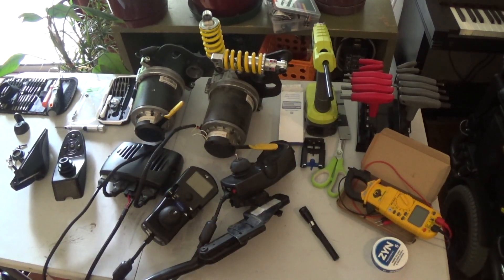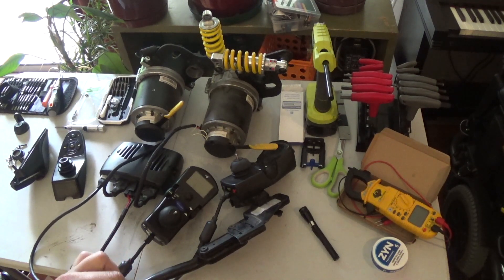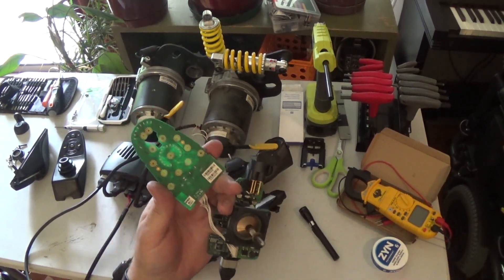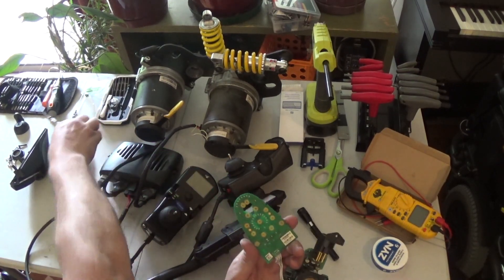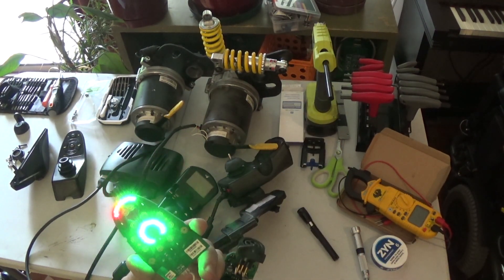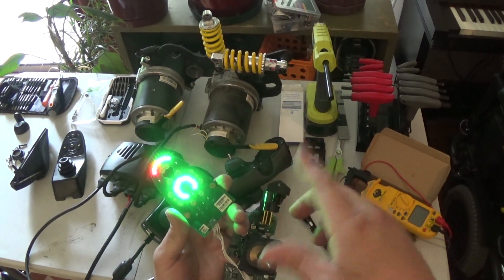We're going to plug this into the MK5 control module just to show that it does in fact work. Even though this isn't in the case, we can still power it up if we're careful. I'm going to use this screwdriver to turn it on. The thing is on now — we've got a couple of motors over here. You'll hear the brakes click off and it'll move.